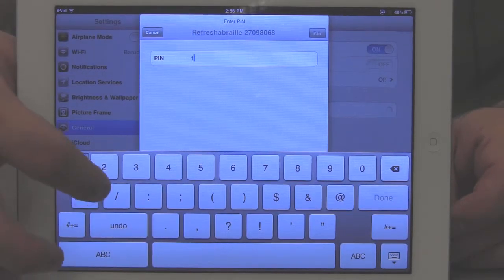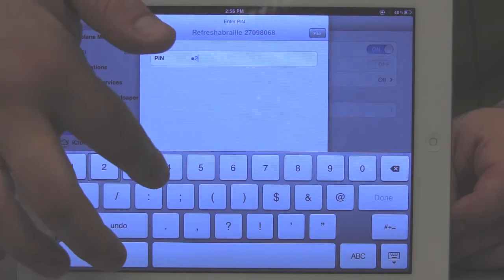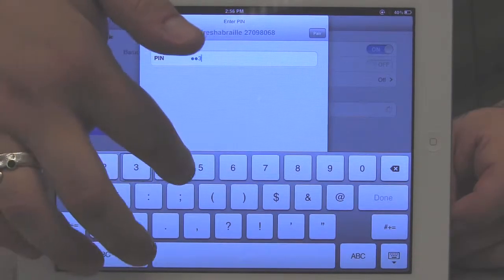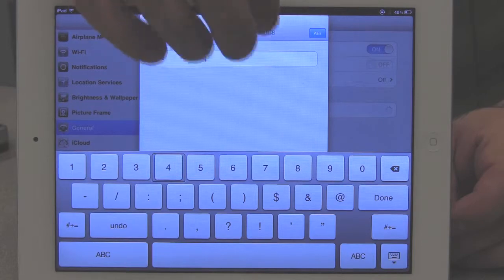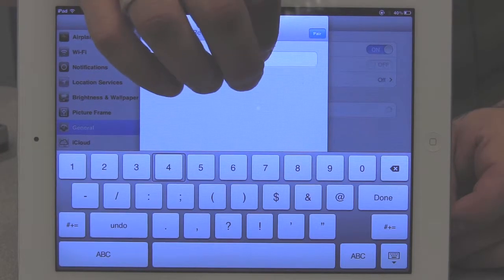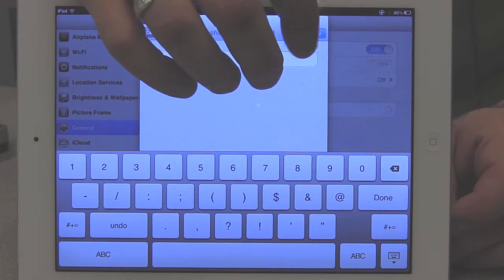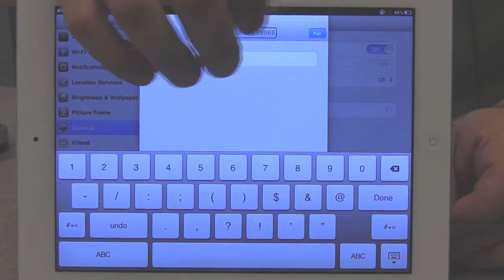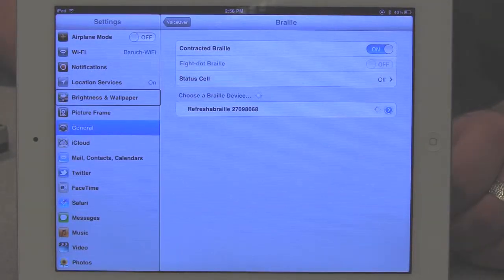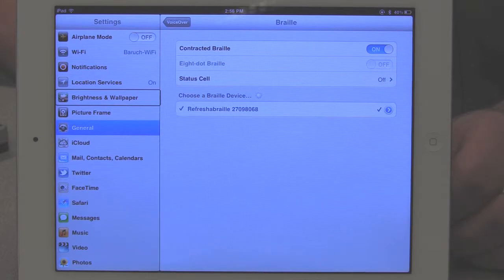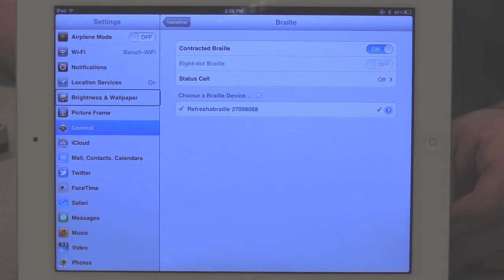And I'm going to type in the PIN. One, two, four, four, three, four. And I'm going to find the pair button and double tap that. Enter PIN, cancel, Refreshable Braille, pair, button. Settings, brightness and wallpaper, button. That sound that you just heard indicates that the pairing with the Braille device was successful.